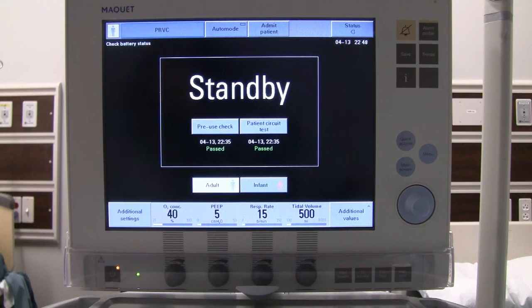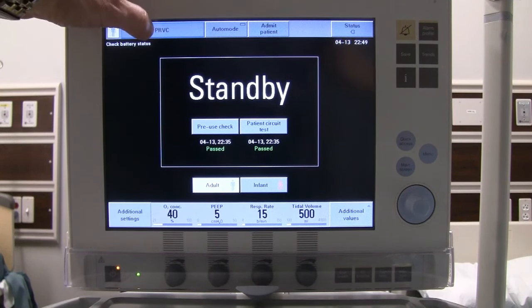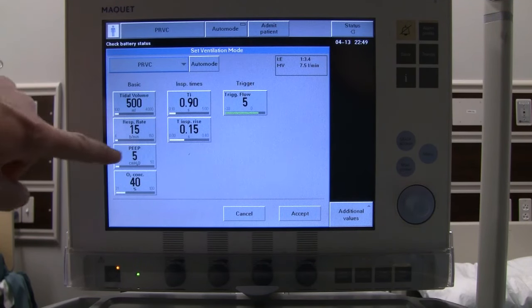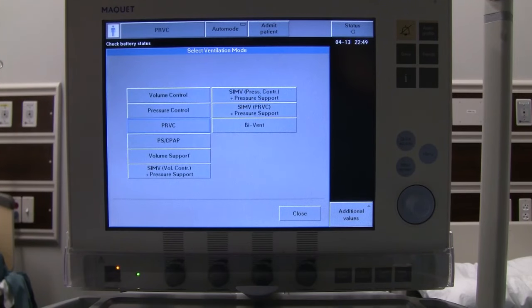We're going to start with volume control. On the main screen you'll notice options for adult and infant — ranging from 0.5 kilos to 30 kilos for infant, and 15 to 250 kilos on the adult side. There are also different software packages for neonates, non-invasive, and neurally adjusted ventilation. Touch the mode at the top of the screen to bring up a list of available modes, and we'll select volume control.